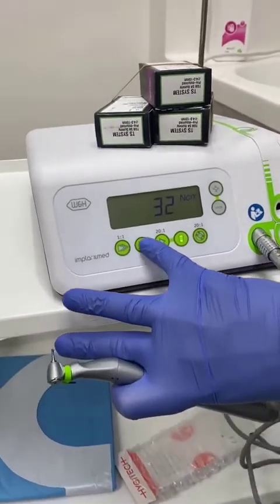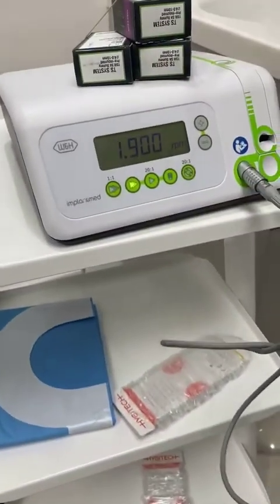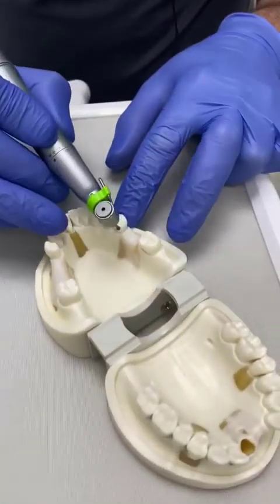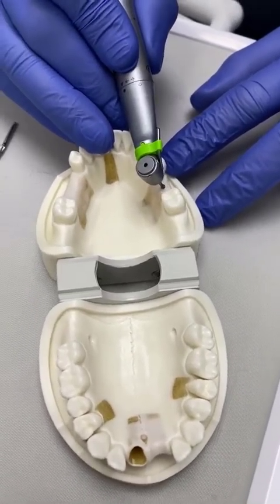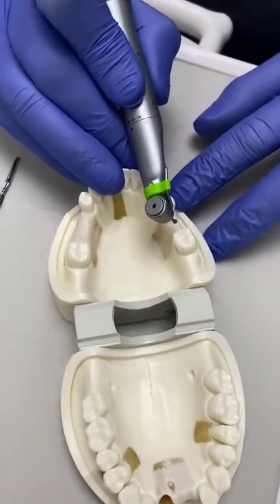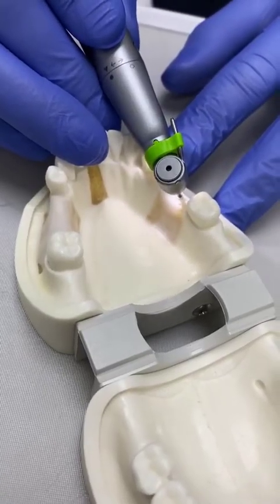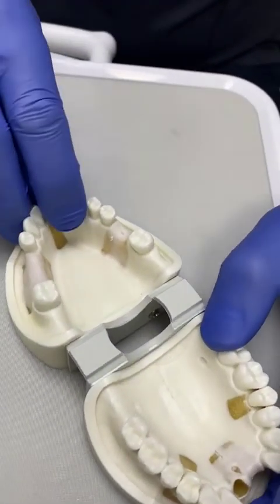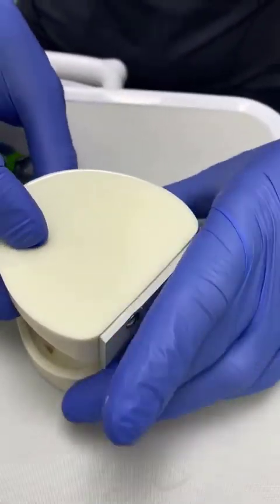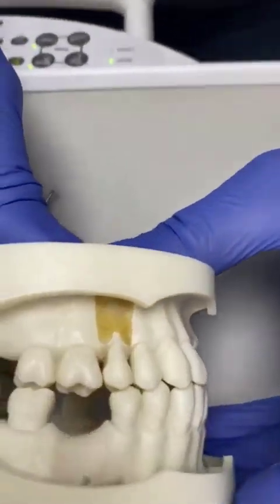We set the machine — this can be done by foot control — and we're not using water here. I'm going to do my initial pilot hole using a rose head, effectively assessing where the cusp tip will be and then making the initial hole. I'm looking from the side to make sure the parallax issue doesn't affect me, and I make my initial hole.